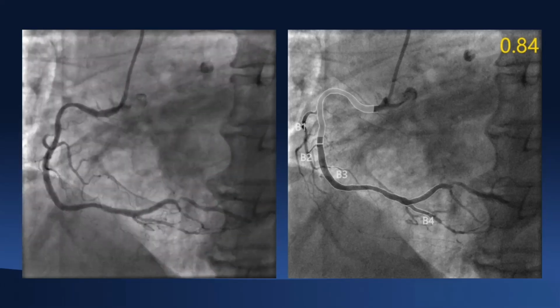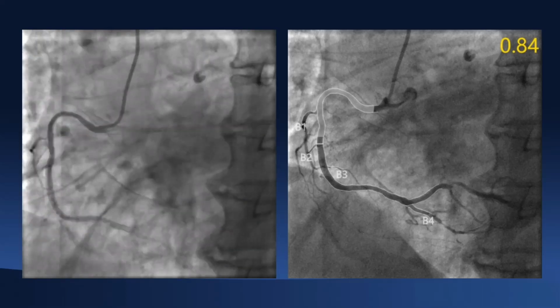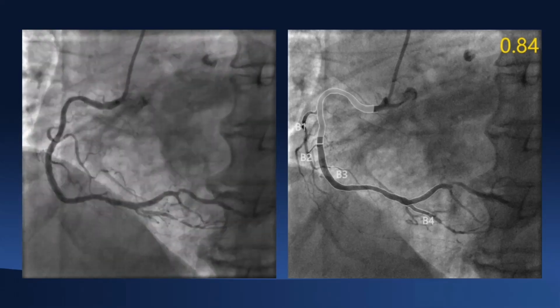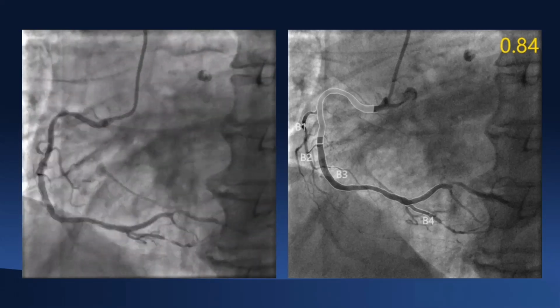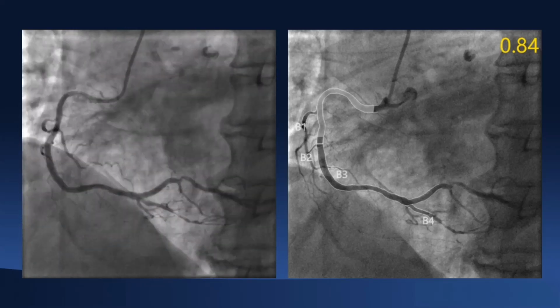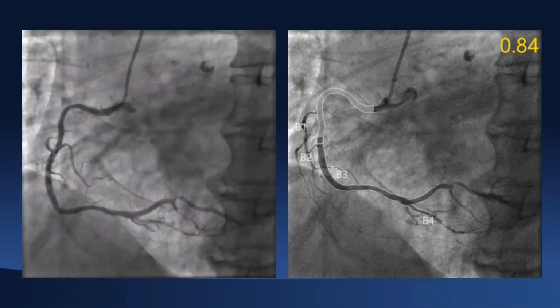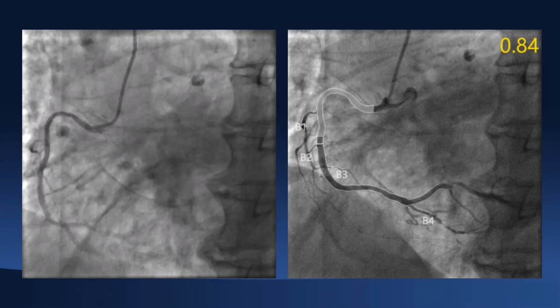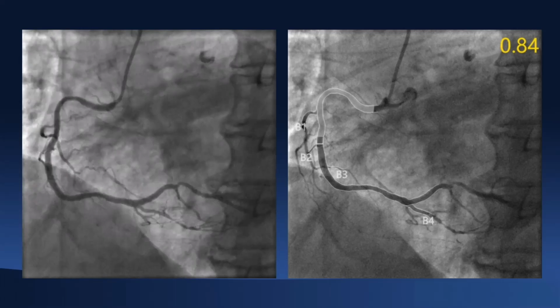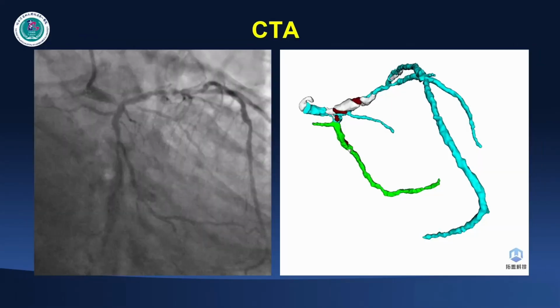Dr. Dong already introduced the left coronary artery bifurcation with severe stenosis and severe calcification. As we know, angiography to detect calcium is inferior to CT angiography. So for this patient, we did the CT angiography and 3D reconstruction. Let's see the 3D reconstruction of this patient's left coronary artery. We have already used this intelligent visualization system several times, to show the audience how to use this system.